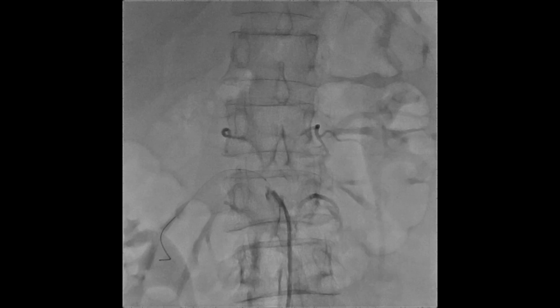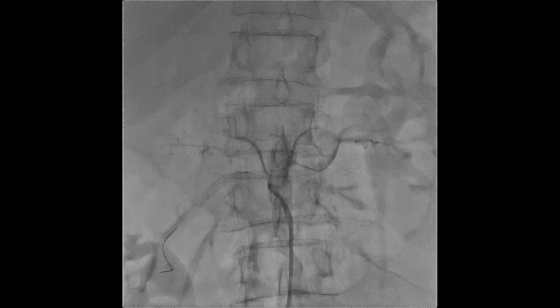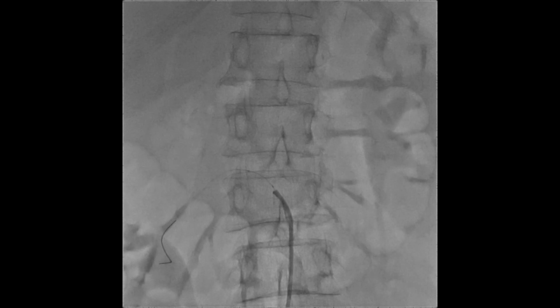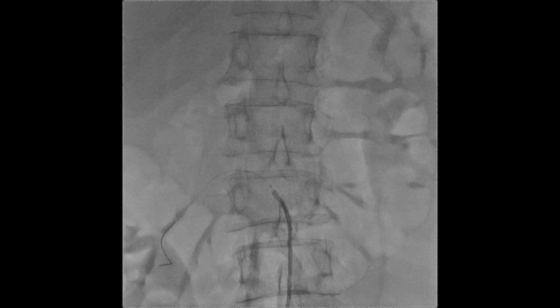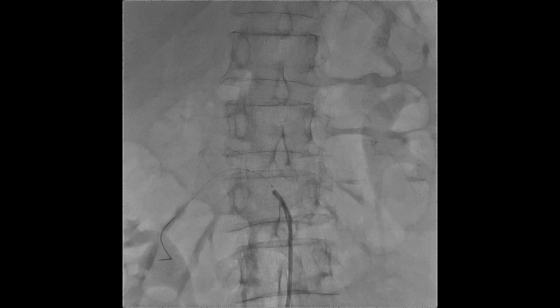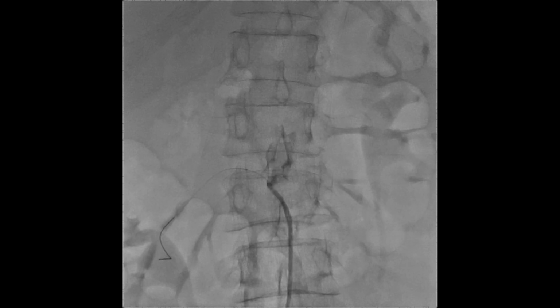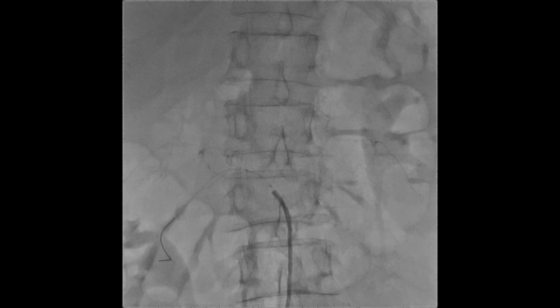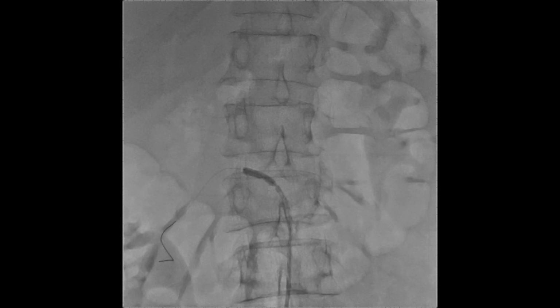But remember, stop inflation as the patient feels pain and check for any dissection or renal artery rupture. Without pre-dilatation, stent may not open fully, and that's a more difficult situation to deal with. So remember that starting with small balloon, pre-dilatation is done with a balloon 1 millimeter smaller than reference diameter of normal renal segment. That's the policy you can adopt. Generally, balloons 3.5 to 4 millimeter in diameter and 8 to 15 millimeter in length are commonly used.